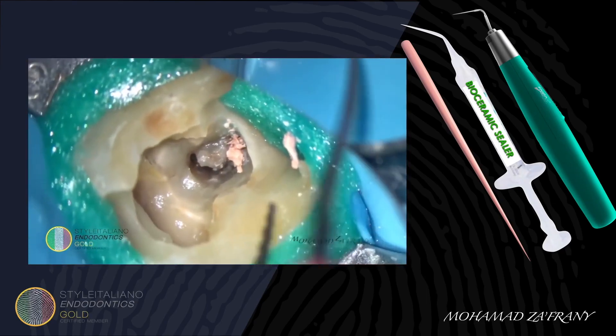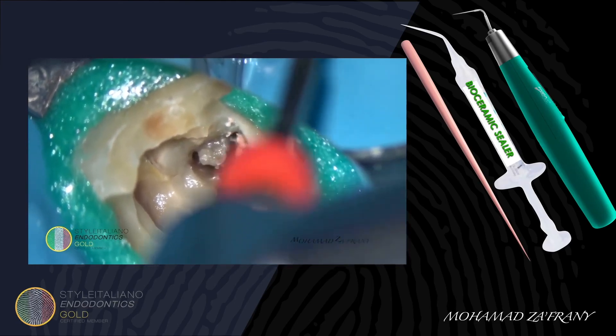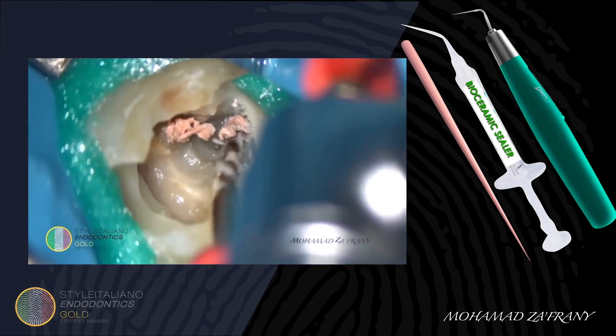Using a larger taper file, I started to remove old gutta-percha from the apical portion of the canal. And you can see here some pus secretion in the isthmus.